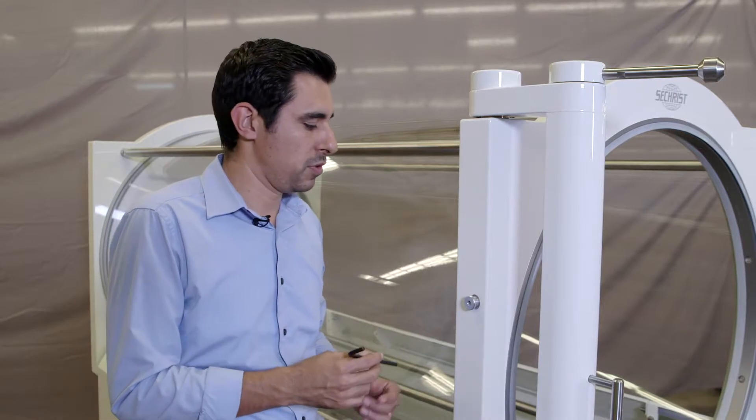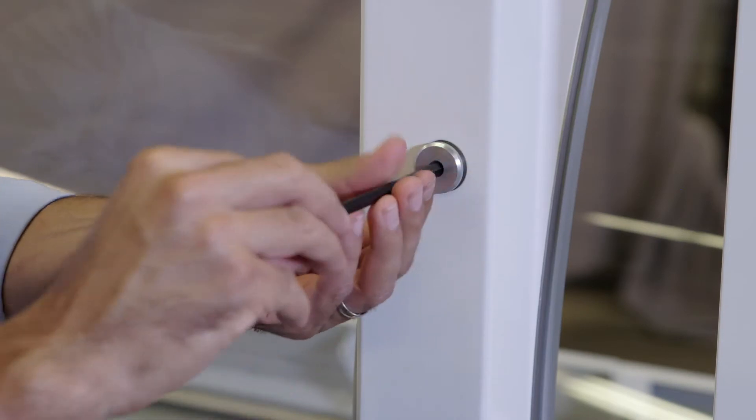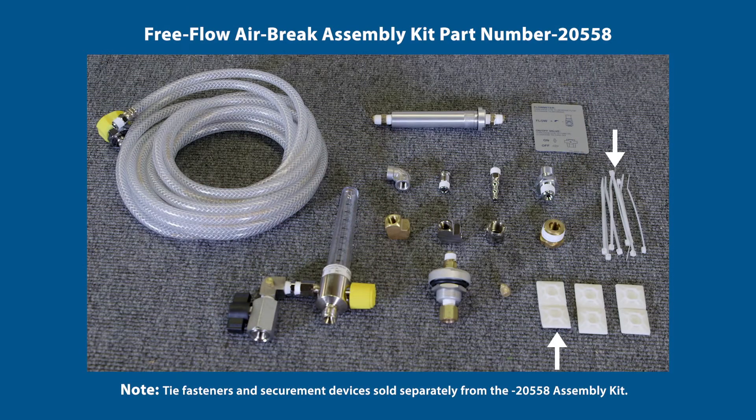The first step is to remove the pass-through plug using a one-quarter inch Allen hex key. In the Free-Flow Airbrake Assembly Kit, you'll find the pass-through plug — that'll be the next step to insert into the door ring.